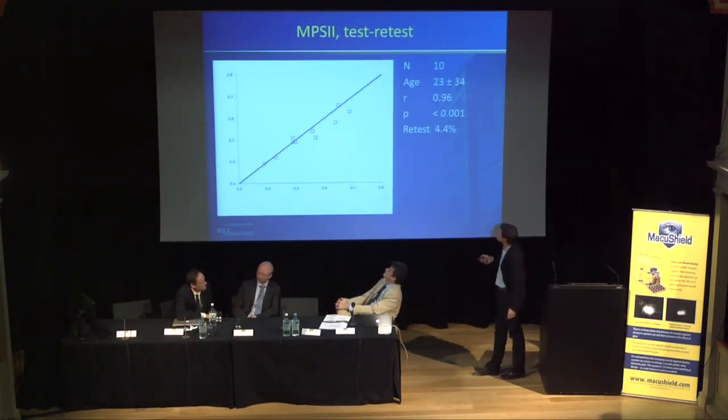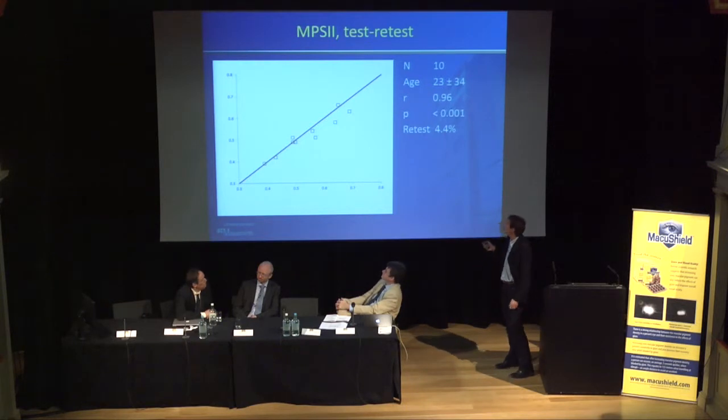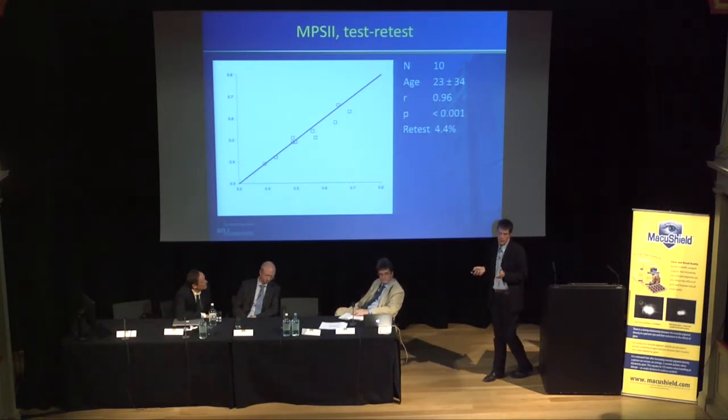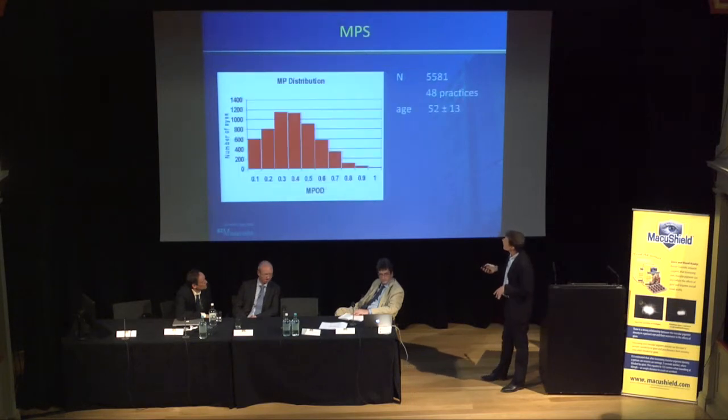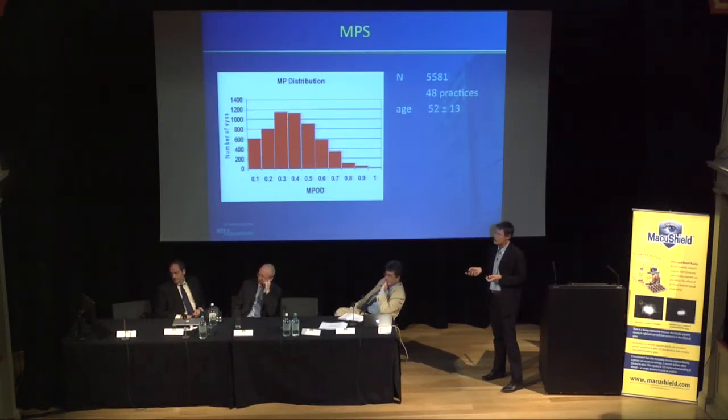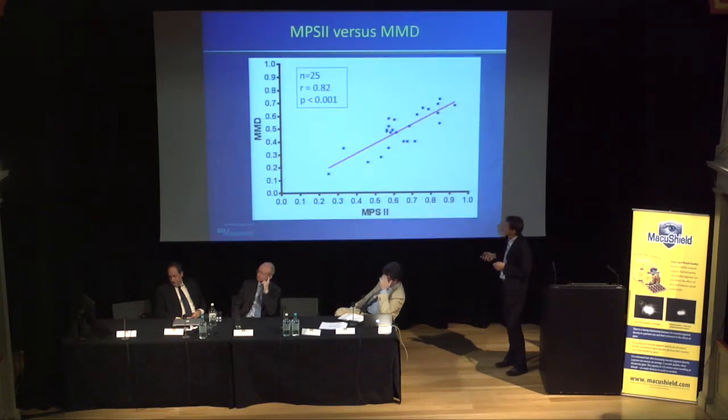And these are measurements done in Singapore recently. They came up with a new device, having a new software update, and they came up with an even better result, which is comparable to what others find. This is a database from a lot of subjects, showing that the distribution more or less looks like what has been found in the literature.